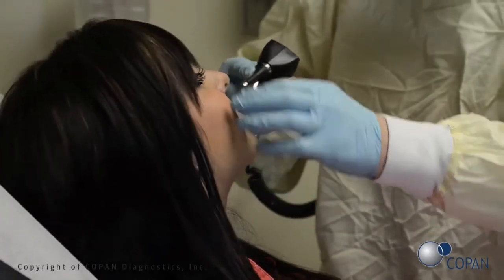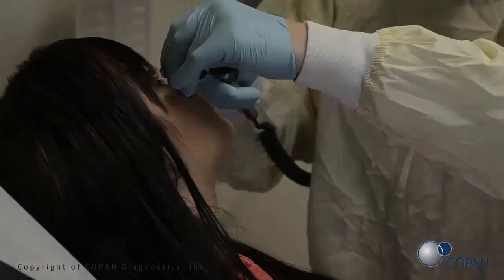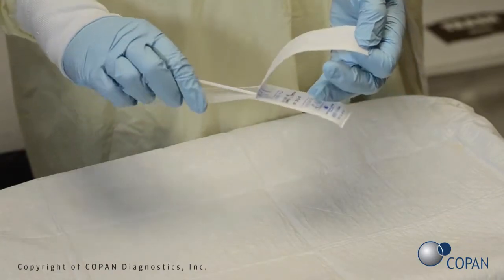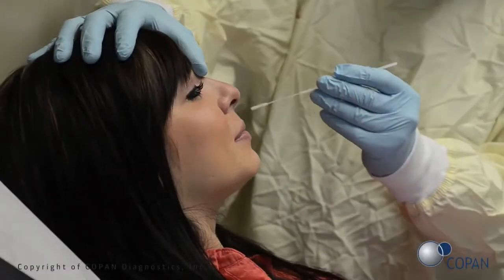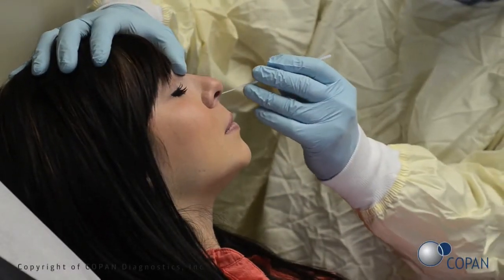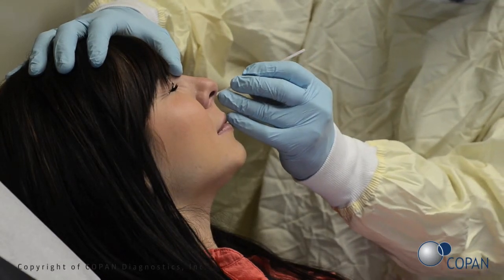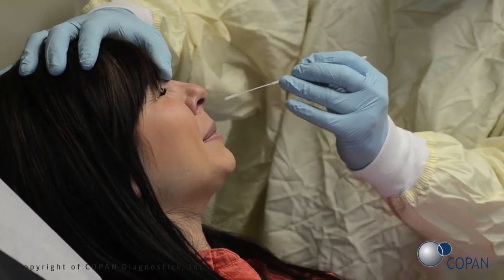Check for nasal obstructions. Open swab package. Gently insert the swab into the nostril. Using a gentle rotation, push the swab until a slight resistance is met at the level of the turbinates. Rotate the swab several times against the nasal wall.